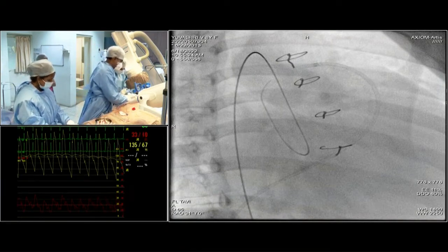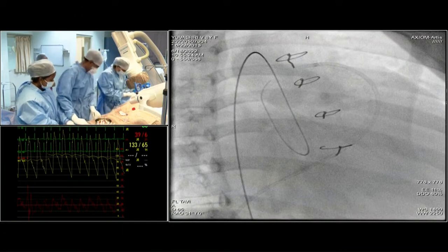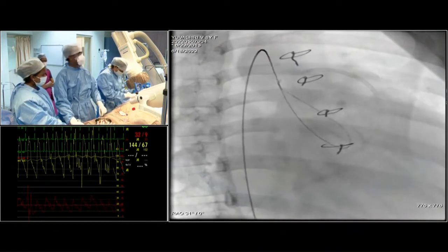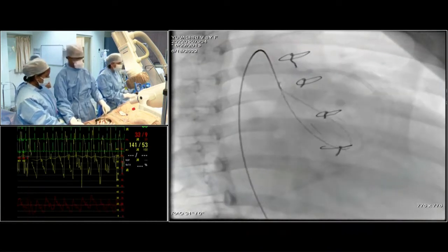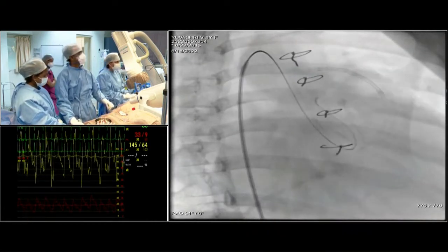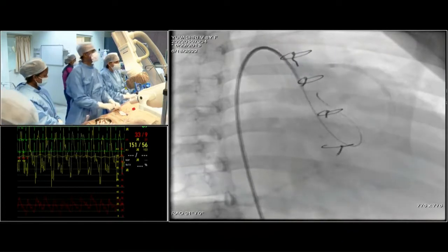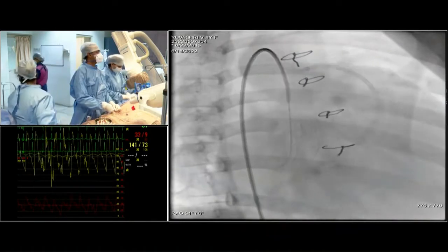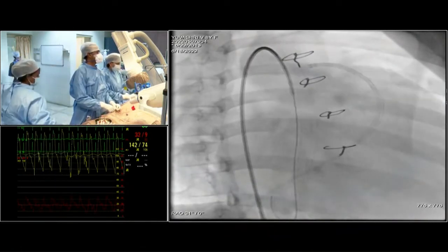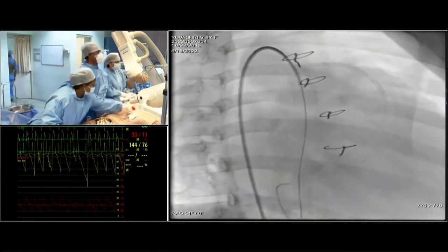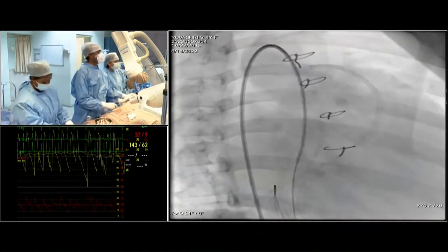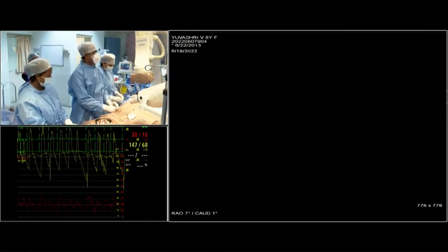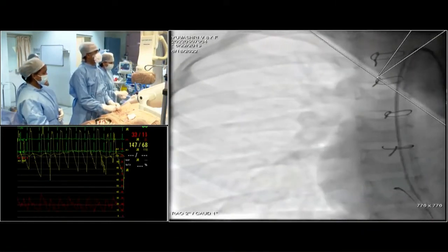For NCC ruptures, AP view is adequate. For RCC-to-RV, you need a lateral view or RAO around 45 degrees, which is ideal. In this case the RAO and AP views are showing a good picture. Now we are crossing the RSOV — I was crossing in the RAO projection and will now move to the AP projection.